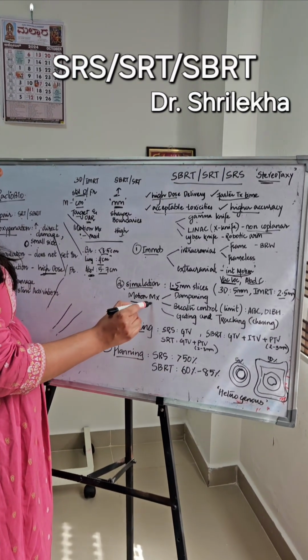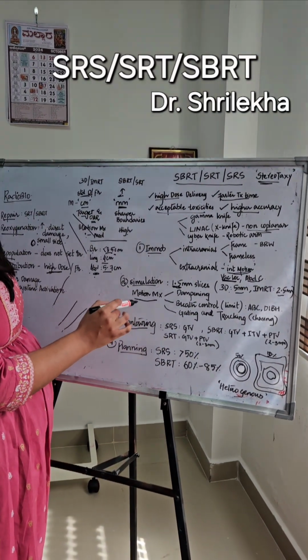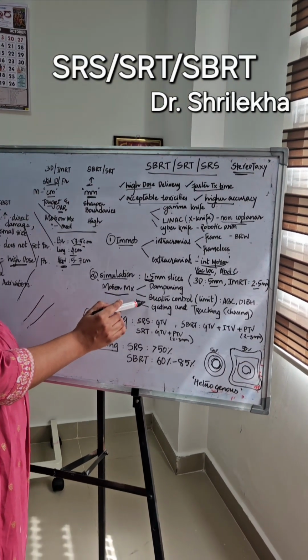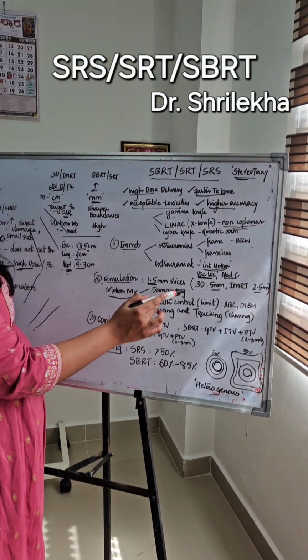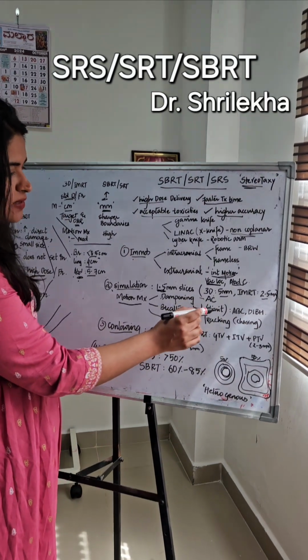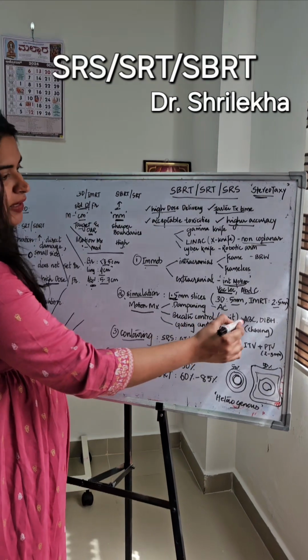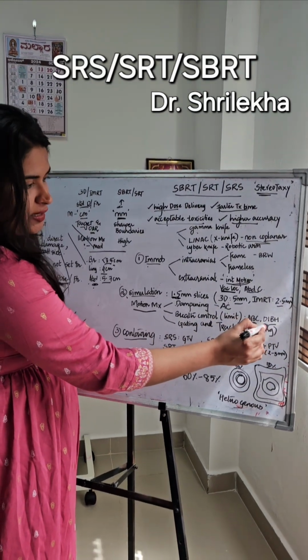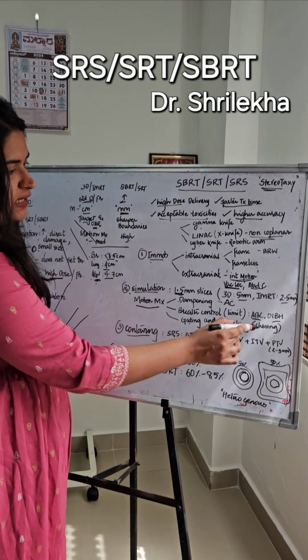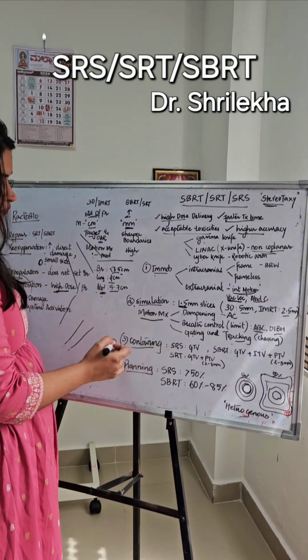And there is high importance of motion management, especially in abdominal cases, which can be delivered through 3 techniques: either dampening, which is abdominal compression, or breath control, which limits the motion, by ABC or DIBH, and gating and tracking. Tracking is basically chasing the tumor, which is usually done in CyberKnife.